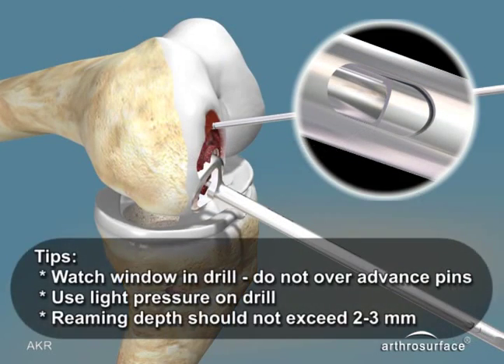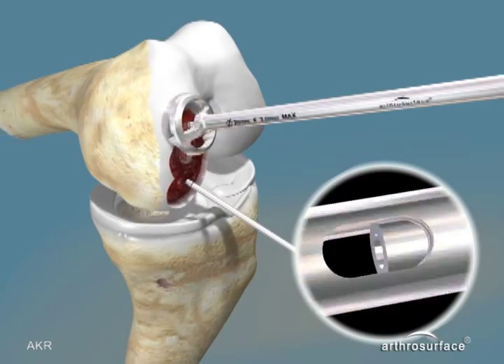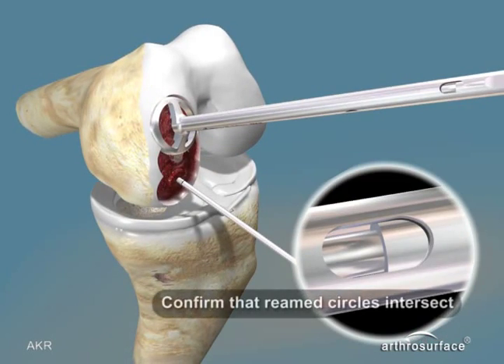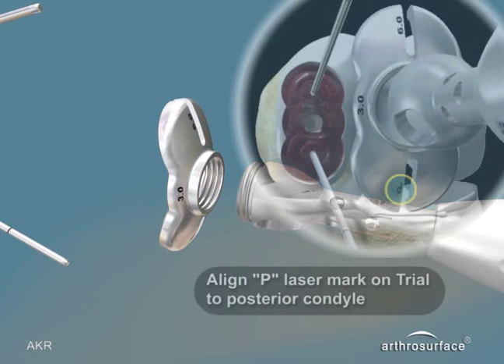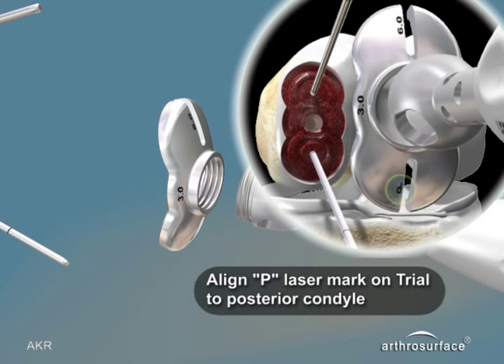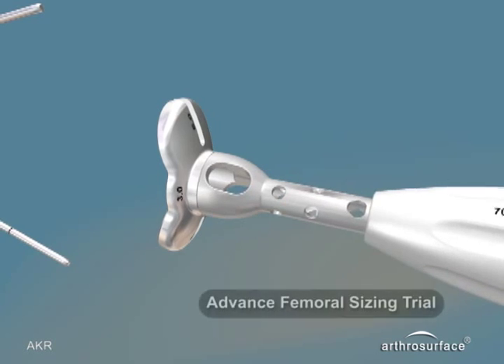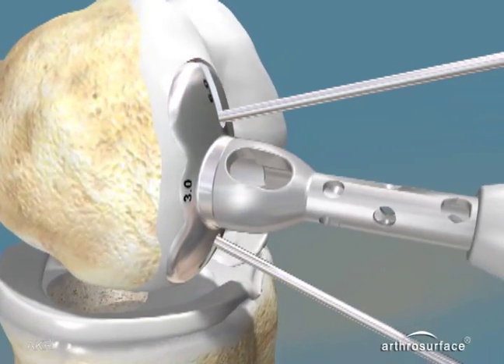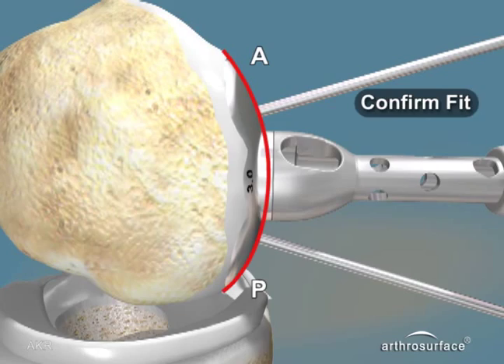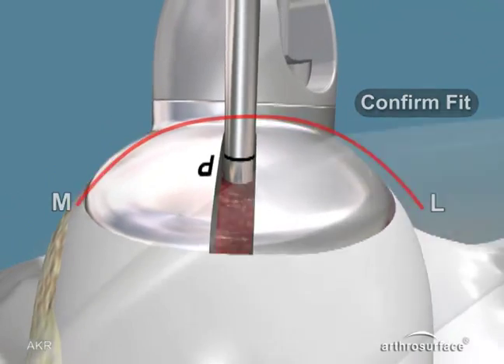Choose the proper femoral sizing trial — it is marked P for posterior — and insert it into the prepared space. Check that you are flush or slightly recessed at all edges, anterior-posterior and medial-lateral. Once fit is confirmed, begin preparation for the taper post.